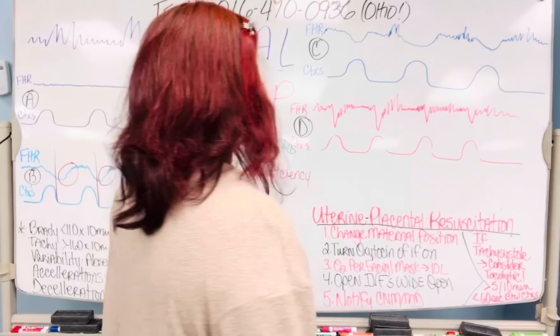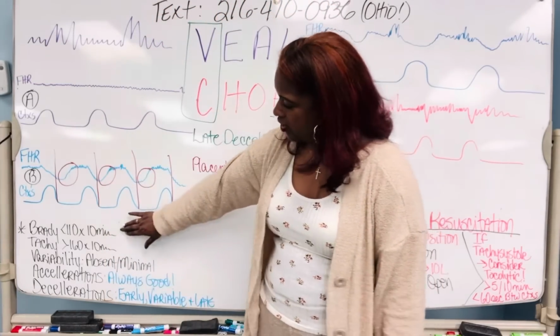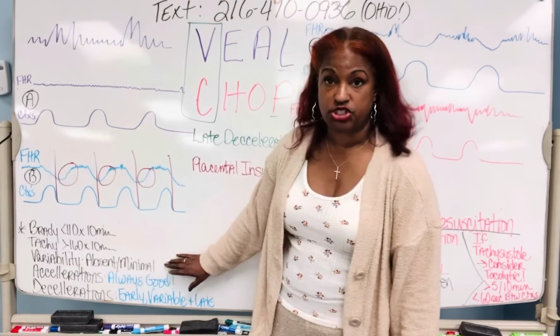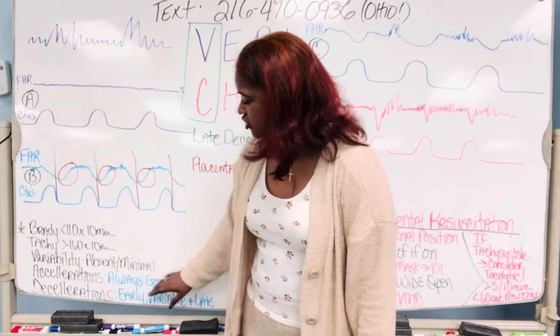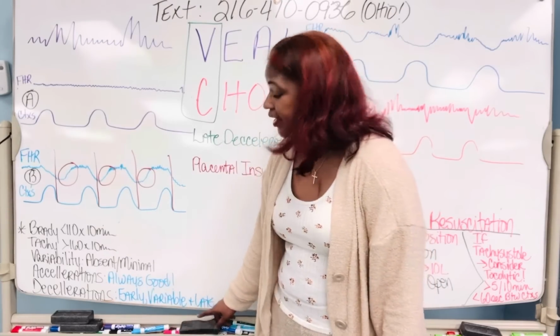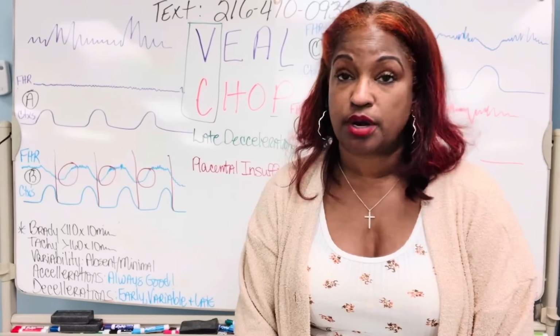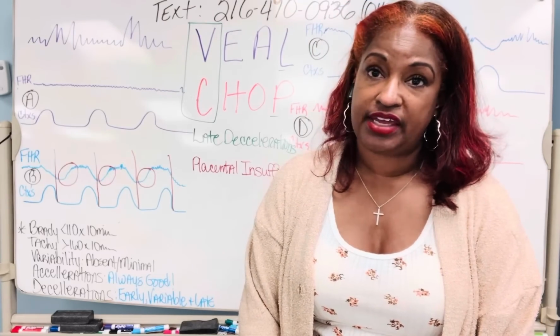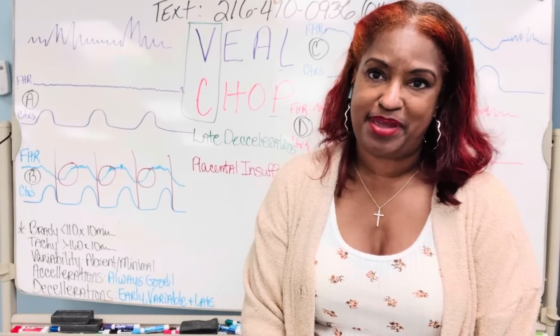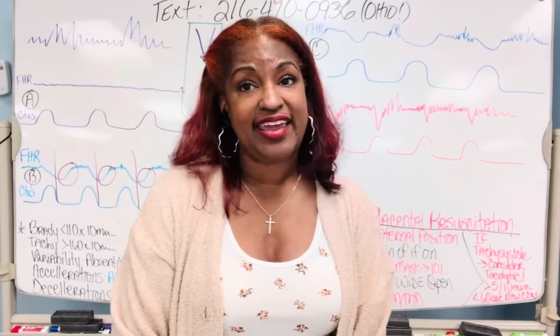Okay, so I hope that that really, really helps. So look, bradycardia, tachycardia, variability absent or minimal is distress. Acceleration's always good. Early, it's better to be early than late. And if you had variable decels, you're experiencing some cord compression, you still got to do something. So early decels are good because they mean a baby's coming. We're going to have a birthday party. I know this is a lot and I'm sorry, but it is what it is.